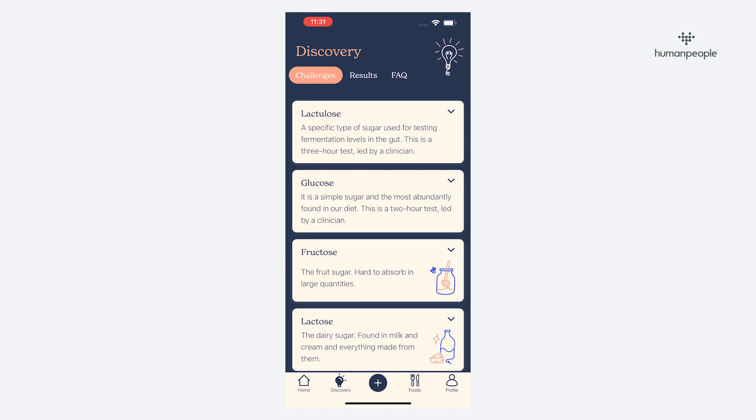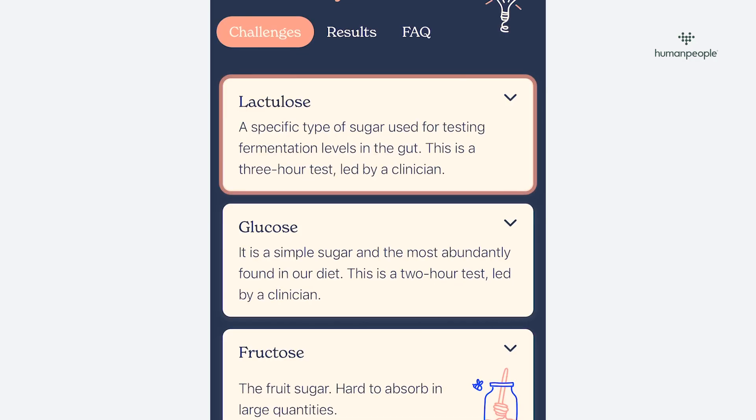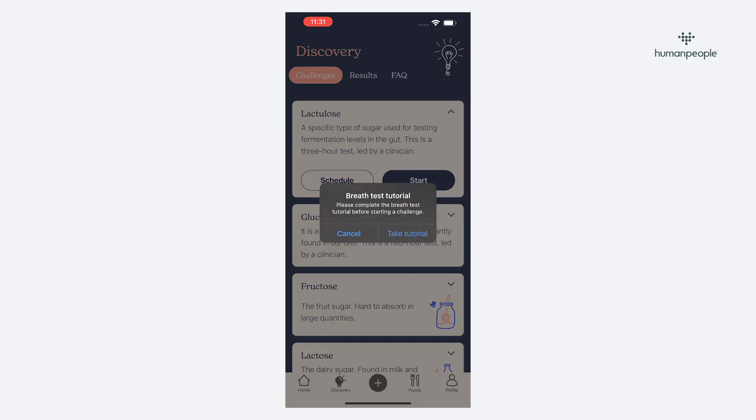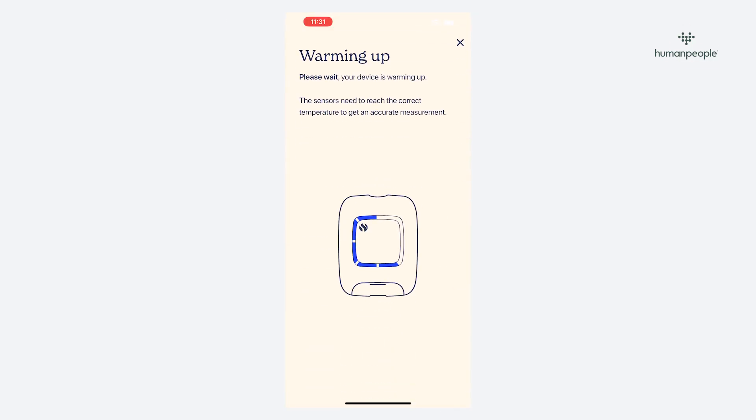You can now start the relevant challenge — this will be the lactulose challenge for SIBO, unless you're allergic to lactose, in which case use the glucose challenge. Double check you performed everything on the preparation checklist and then begin the test. The device can take five minutes to warm up to temperature.